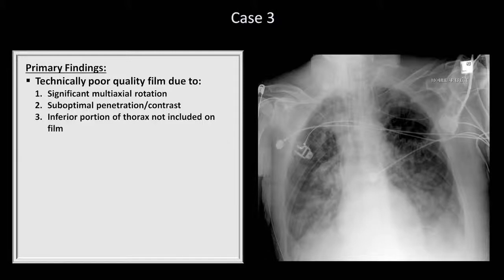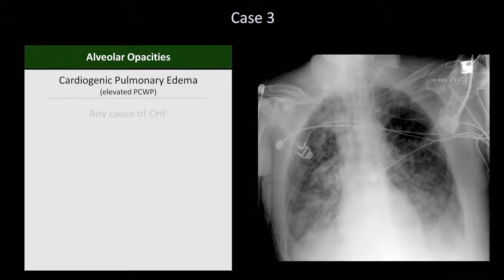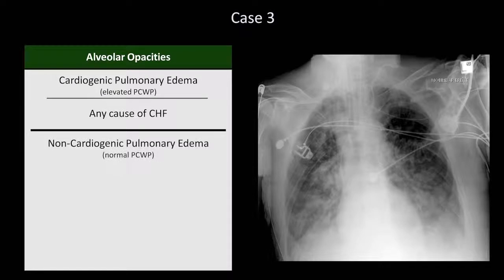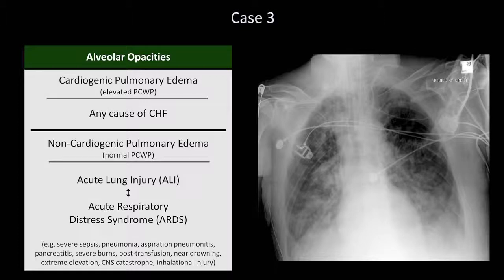Moving on to the actual findings, there are obvious diffuse bilateral patchy alveolar opacities with probable bilateral effusions. The etiologies of diffuse alveolar opacities can be divided into two categories. First, there is cardiogenic pulmonary edema, which is associated with an elevated pulmonary capillary wedge pressure, which is a surrogate for left atrial pressure. Any cause of CHF can lead to cardiogenic edema. The other category is non-cardiogenic pulmonary edema, which has a normal wedge pressure. Diffuse non-cardiogenic edema is often placed into the spectrum between acute lung injury and acute respiratory distress syndrome, or ARDS. The distinction between ALI and ARDS is simply based on how hypoxemic the patient is. There are many etiologies of non-cardiogenic edema, most notably severe sepsis, pneumonia, and aspiration pneumonitis.